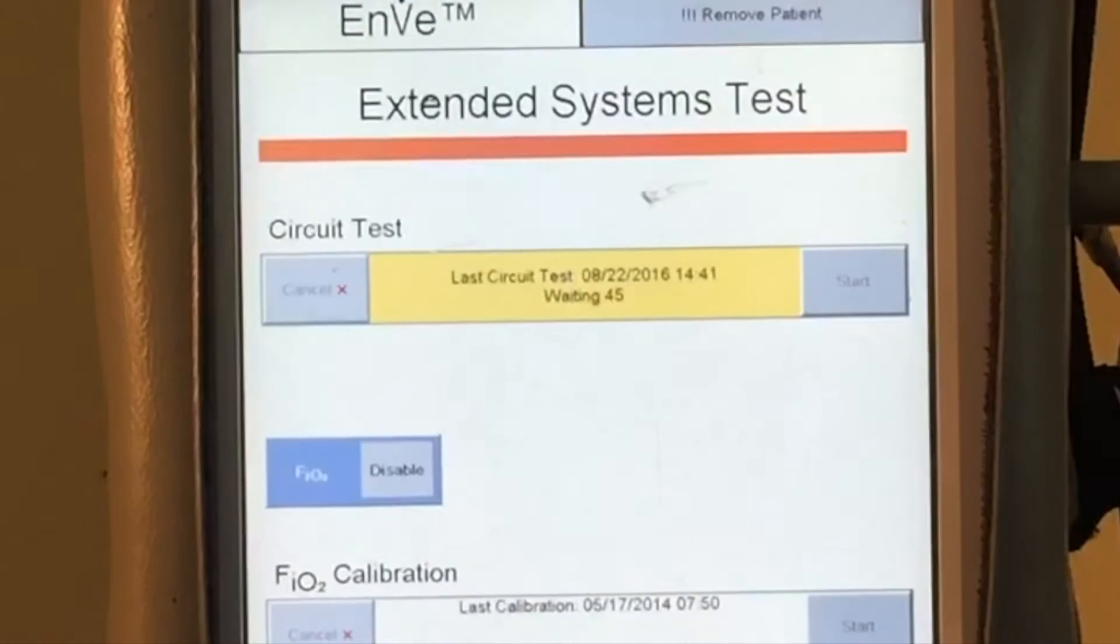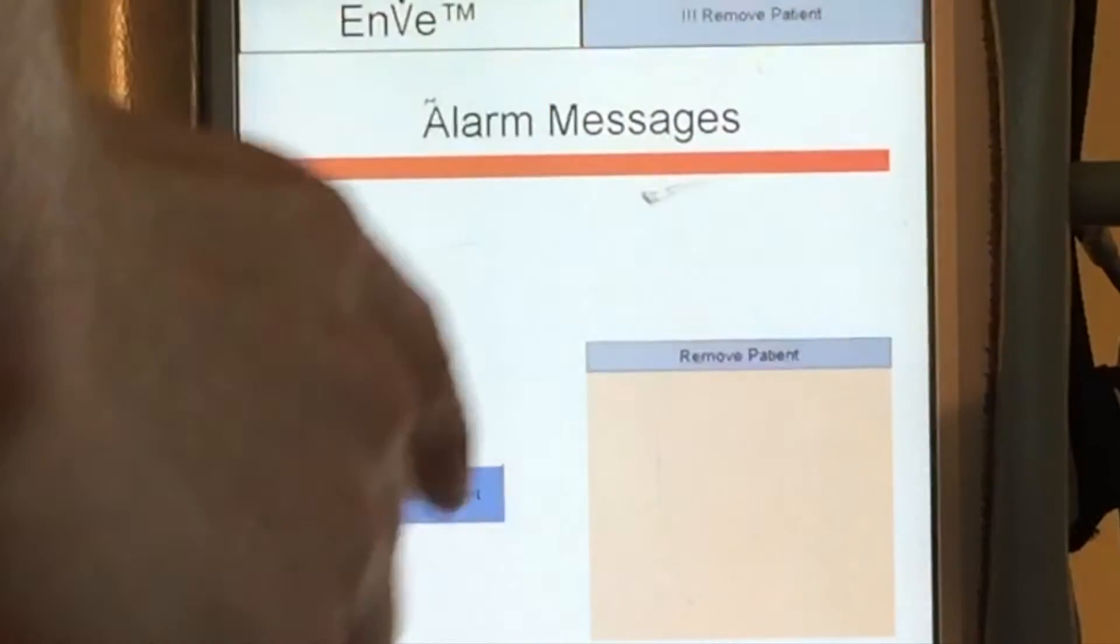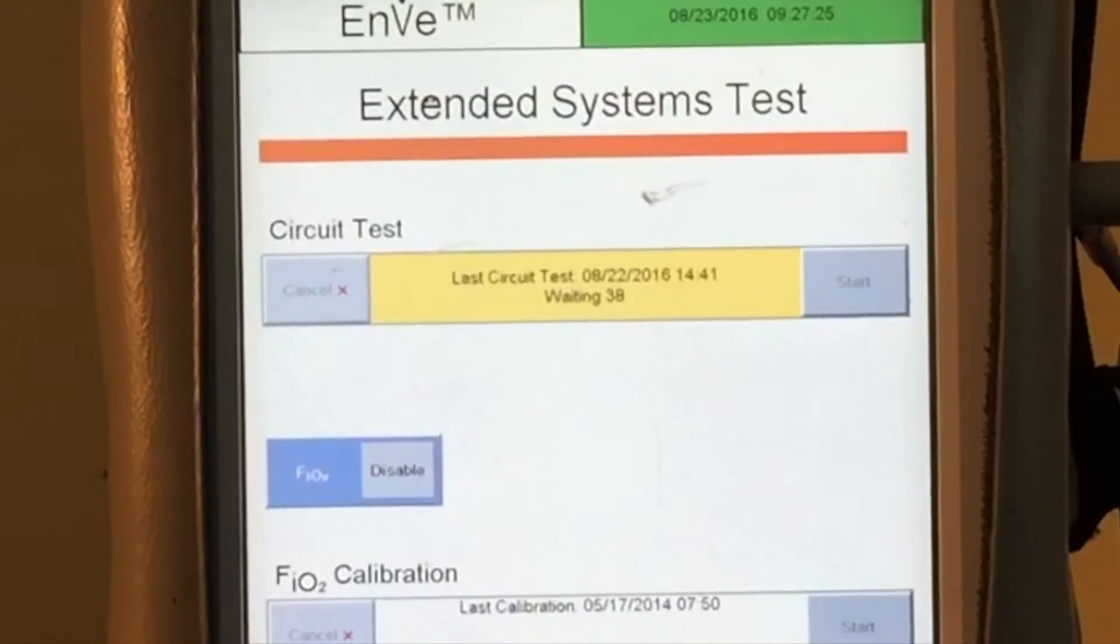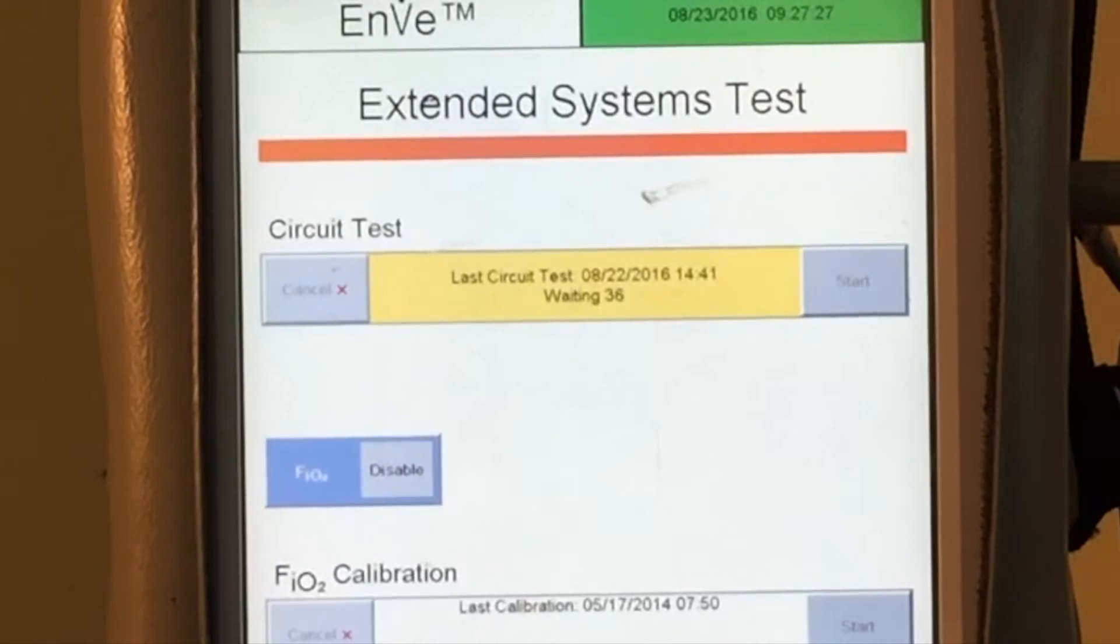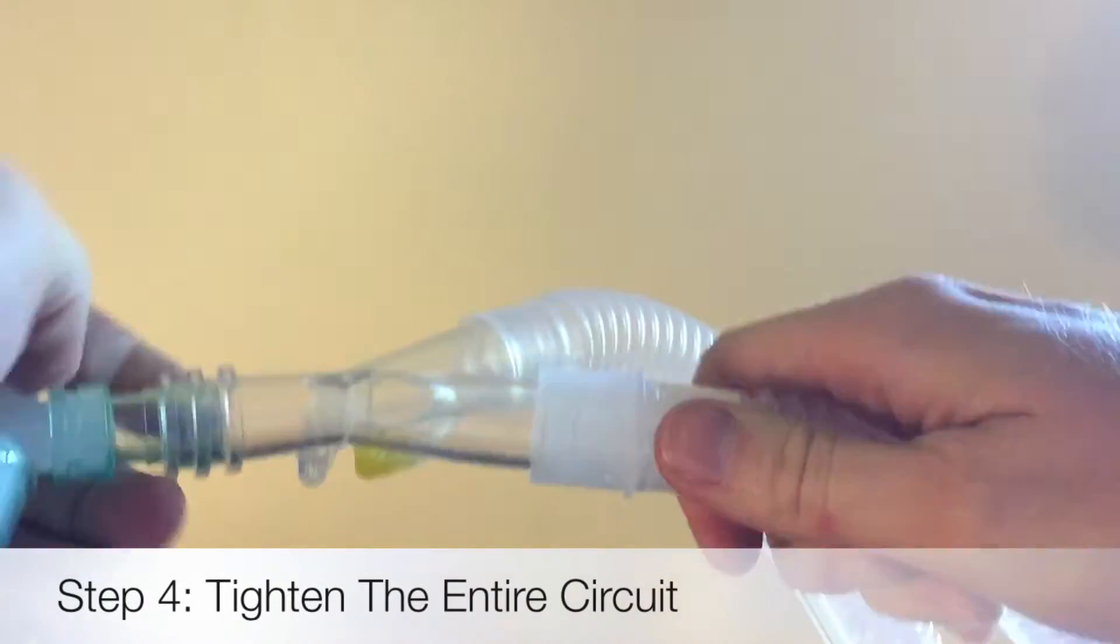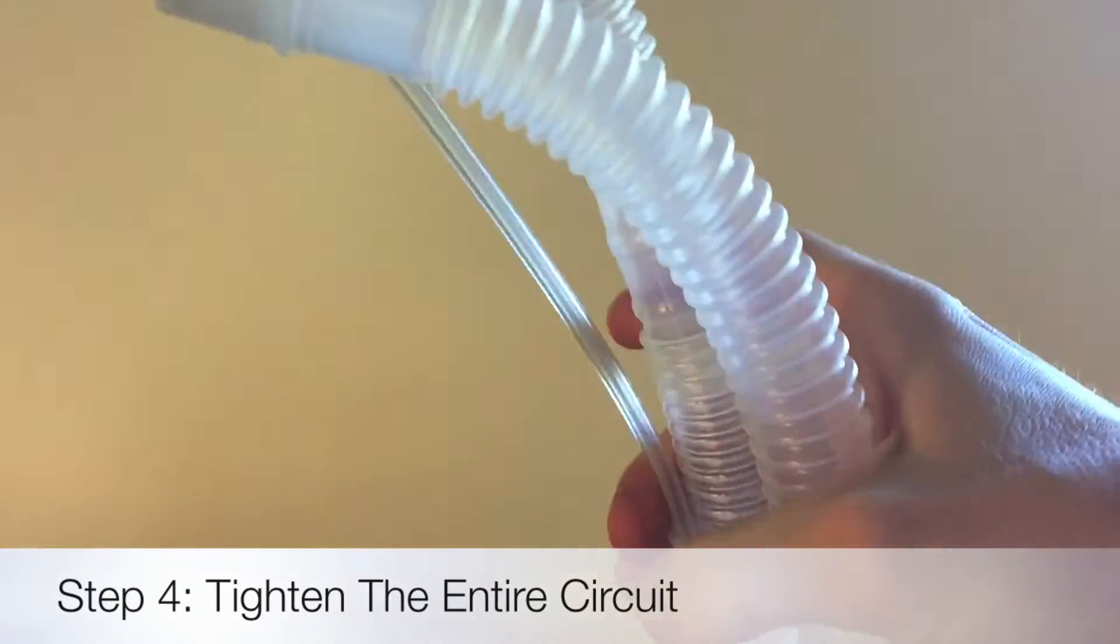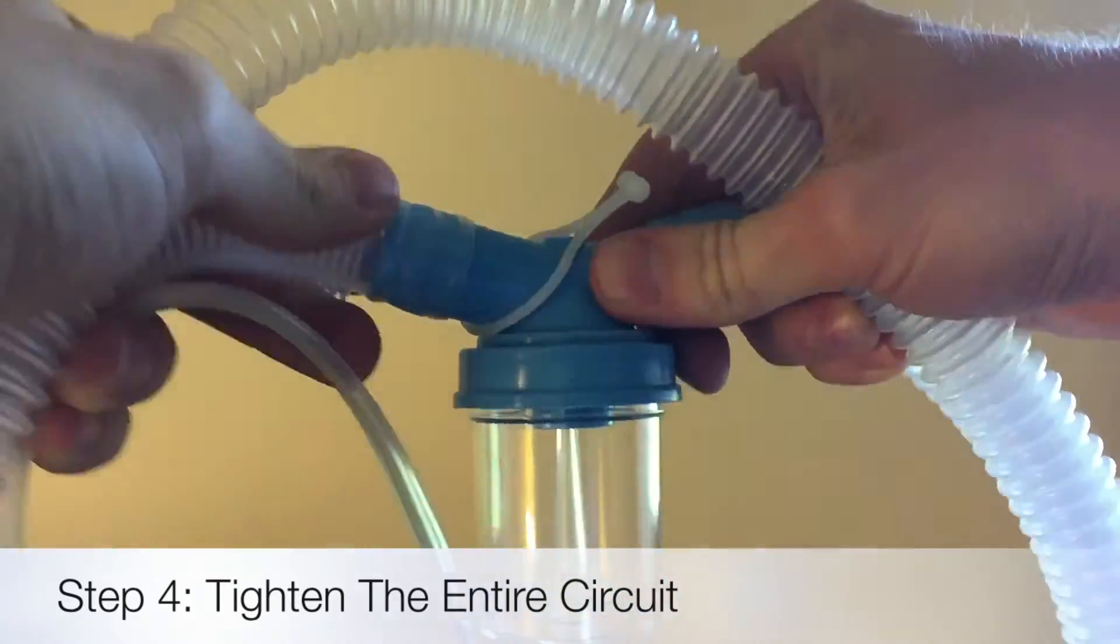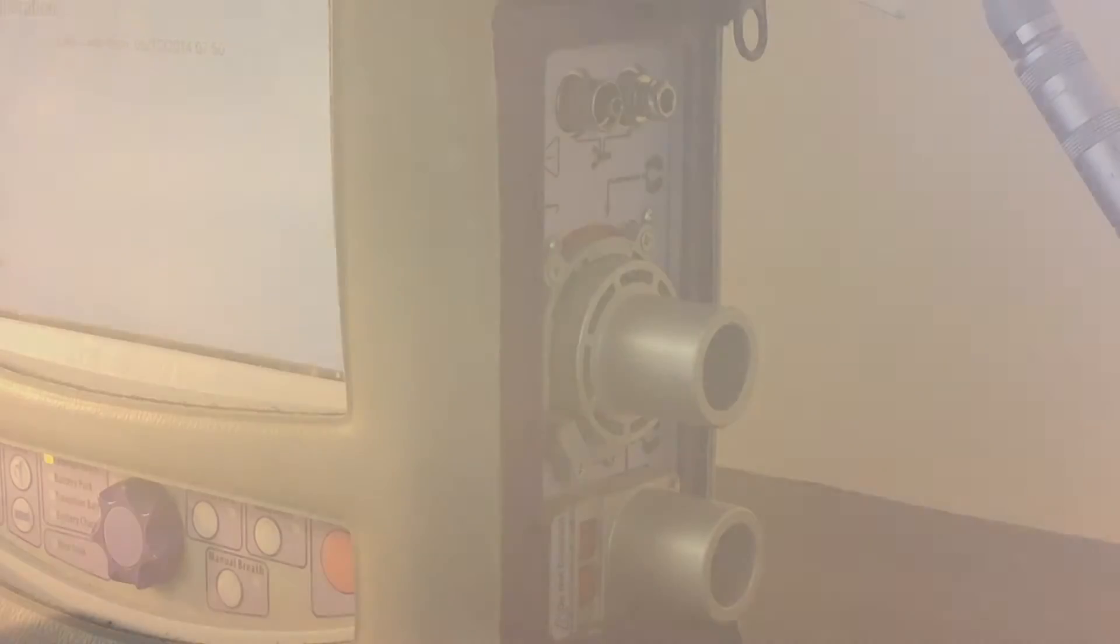Now you'll notice way up at the top it says waiting 44, 43, 42 and that's the vent performing self-tests. So it's not ready to perform a test yet. So what you're going to go ahead and do is grab your circuit and then we're going to tighten it. Start at the top, tighten it here at the Y and then go and follow down. You'll see a water trap right here and this is another spot where it can leak. So go ahead and tighten that.